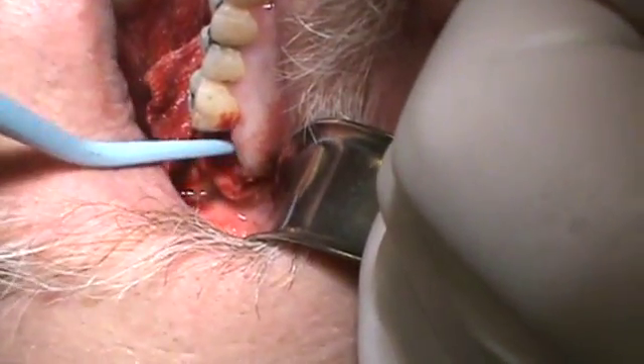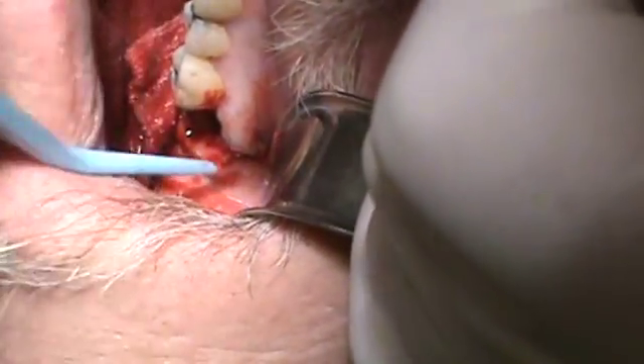If they're not bleeding, sometimes I'll just drill little holes in the bone, get some bleeding, and try to get a little clot in there for him.